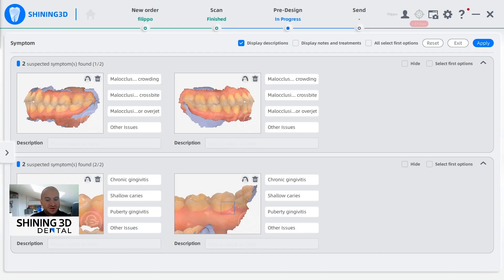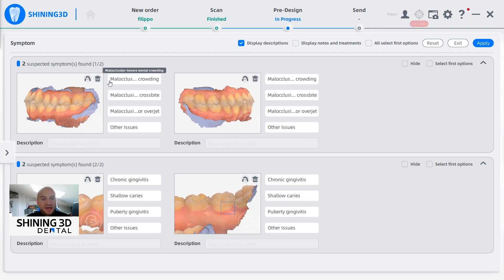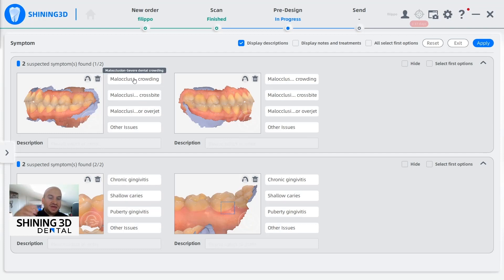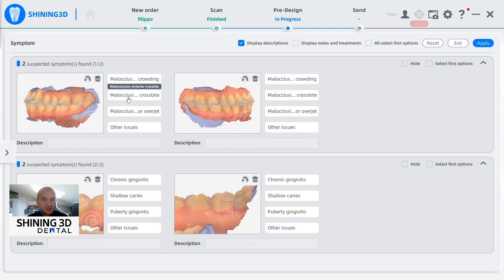Here we have the result of the artificial intelligence calculation. As you can see, the computer finds these defects completely automatically, and also suggests what the issues could be referred to in the patient's mouth. The computer lists on top the most probable kind of problem, so the doctor can simply select the correct one.